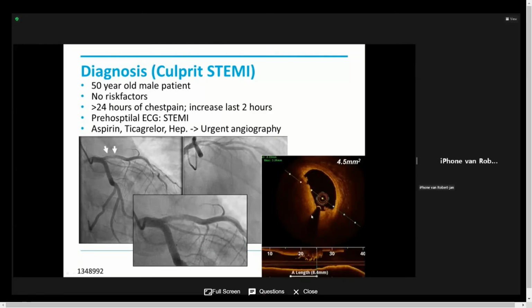So we decided to do the OCT imaging, giving us additional anatomical information for this patient. And you can recognize, I think, the OCT images where we see a nice continuous vessel structure with all signs of red thrombus dropping off the signal. And if you look at the longitudinal reconstructed images, you can also see the intact vessel wall and the thrombus, which is usually at several locations on top of it. And we couldn't identify a plaque rupture at that moment.